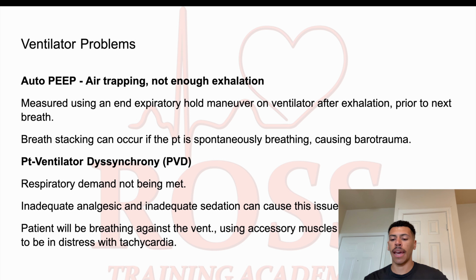So you're going to start seeing that hypertension, tachycardia. They're going to start breath stacking. Alarms are probably going to start going off on your ventilator. And the patient's just going to appear as if they are in distress. And if you just can't figure out another reason why they're in distress, it's probably going to be PVD. And so we either need to sedate and or start changing our ventilator settings to meet the demands of the patient.